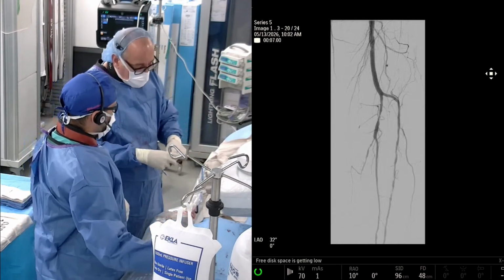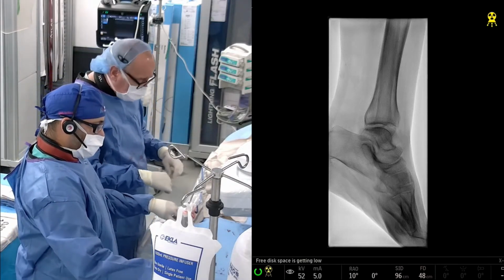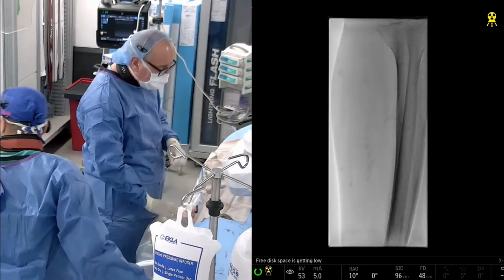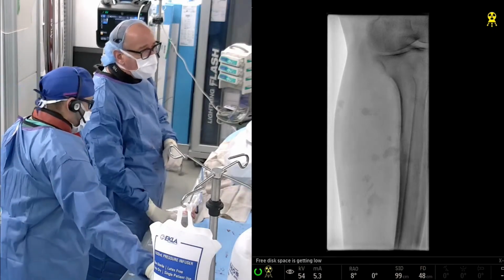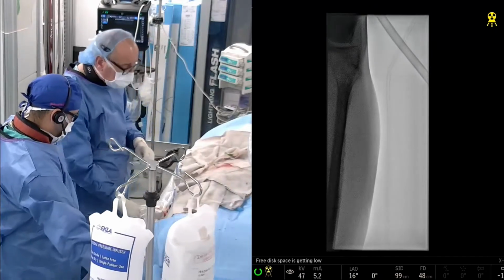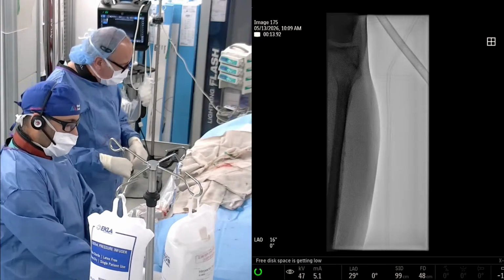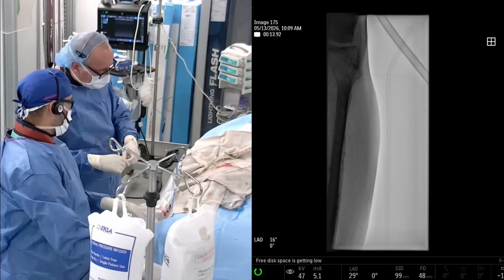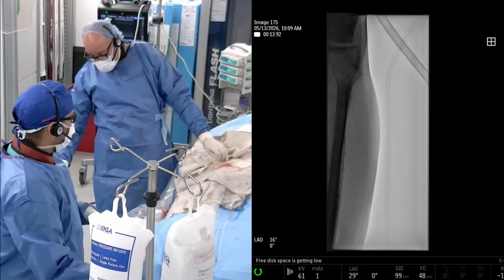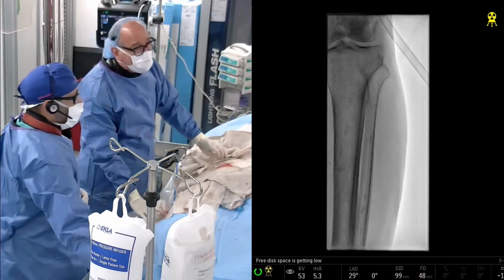And then what's your anticoagulation regimen right now? So we literally only gave 5,000 of heparin a little while ago. We're going to check ACTs intermittently. And I think for me, the good checkpoint is when we've crossed. I'm hoping that once we've crossed this successfully, we're going to be able to identify whether we want to use IVUS to size this, whether we want to use some other technology, and then how we choose what kind of treatment strategy we're going to use to get this done.